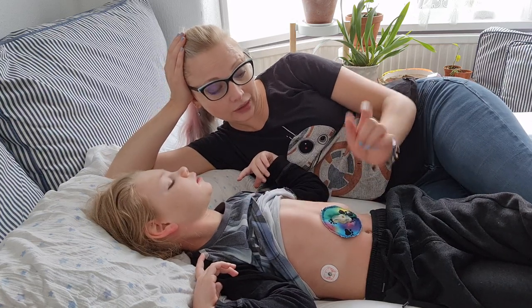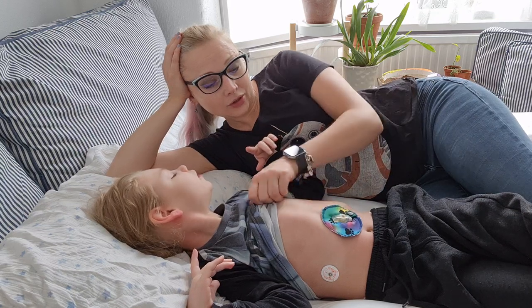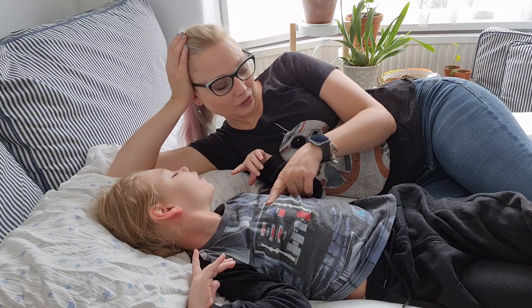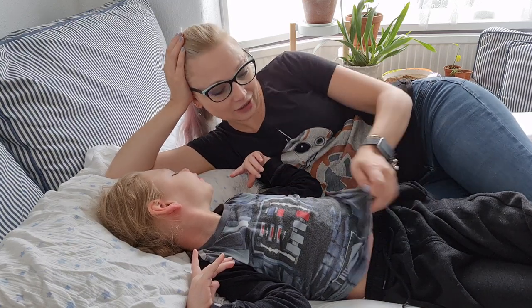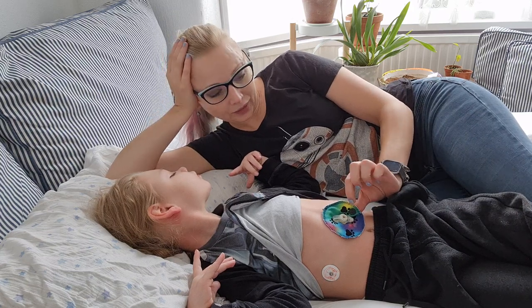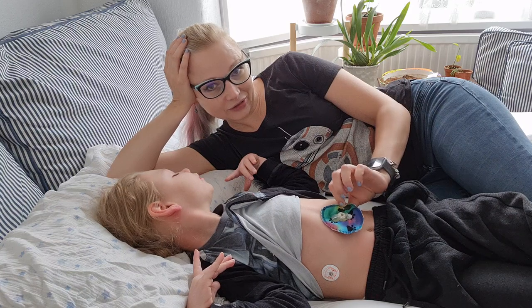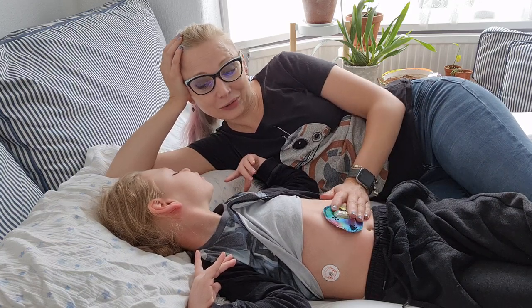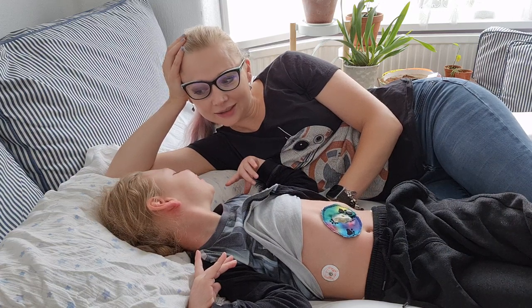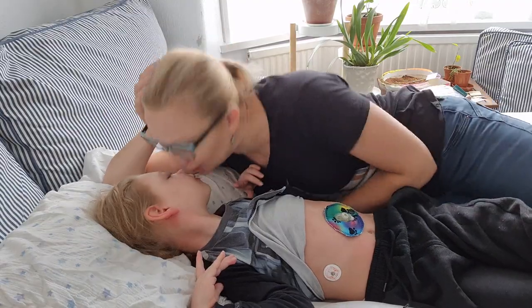But the first thing I'm going to do is clean the stoma and get a clean tubi pad on. And do you like how we're rocking Star Wars today? She's got her Darth Vader top on, I've got my BB-8 top on, and funnily enough, I know you can't see it here, but the snap on this tubi pad has got Darth Vader on it as well, and it's so cool. Come to the dark side. We have cookies.